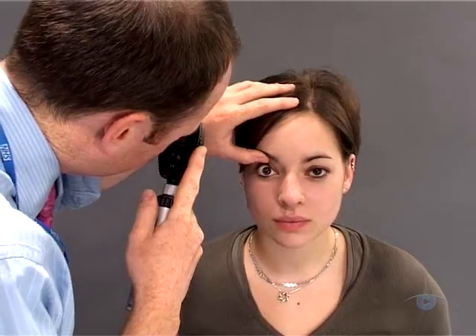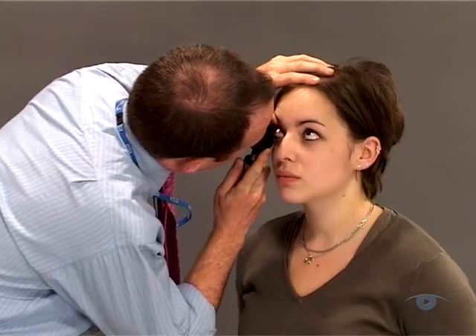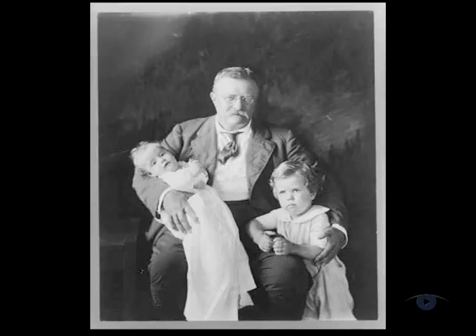Finally, you should realise that as with any clinical skill, proficiency comes at a cost. You need to practise ophthalmoscopy regularly to develop and maintain the skill. So try and get into the habit of using it routinely as part of your normal examination. The sooner you start, the quicker you'll get up to speed.